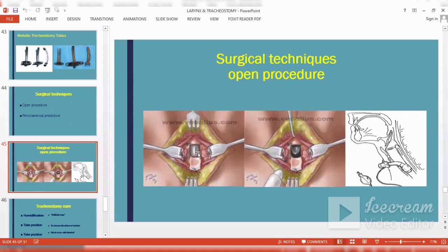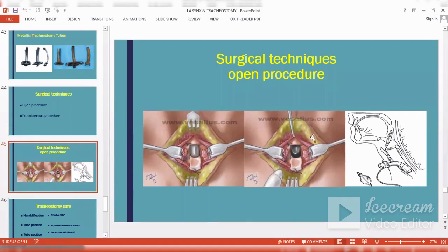After giving the incision, retractors are applied and the strap muscles are separated in the midline to expose the thyroid isthmus, which is then divided and ligated. The trachea is then incised in the form of a flap, and a cuffed tracheostomy tube is inserted to prevent aspiration, tied around the neck, and the incision is closed with one or two sutures around the tube.